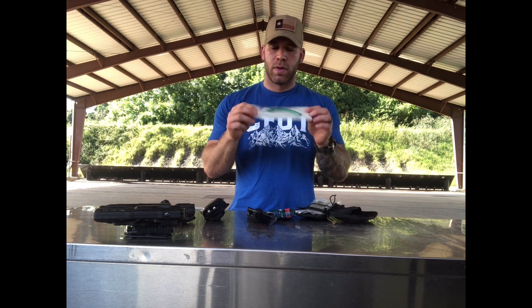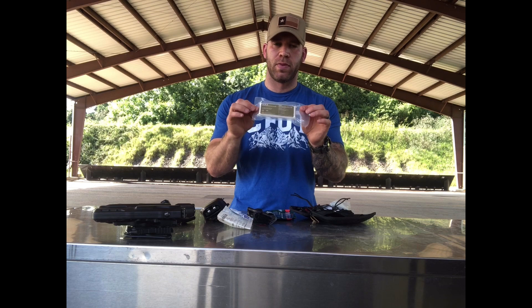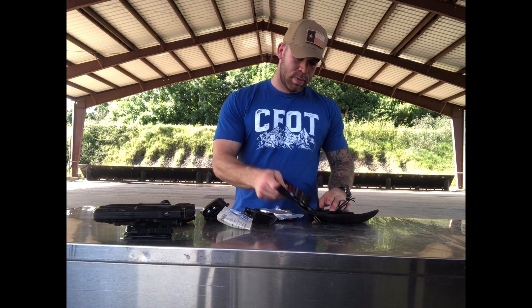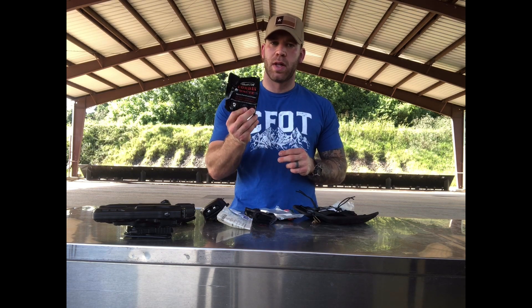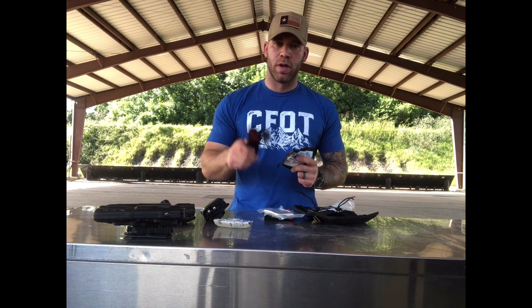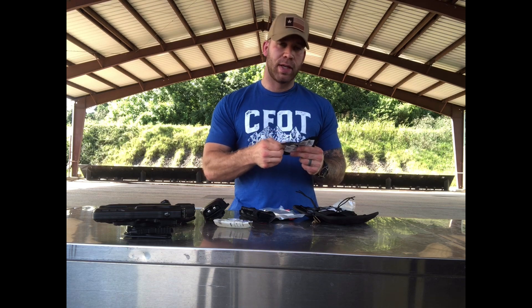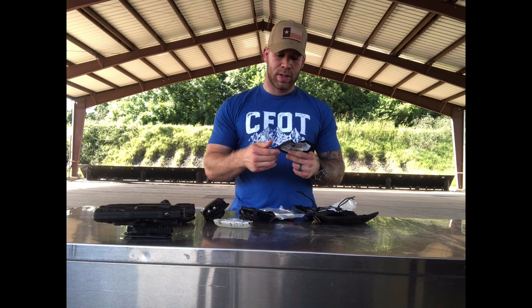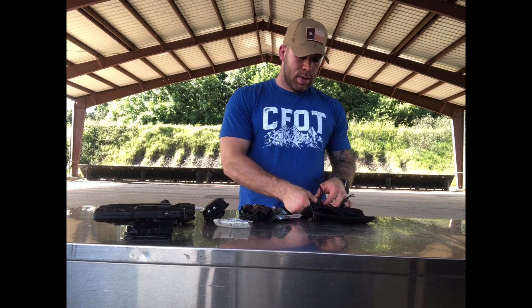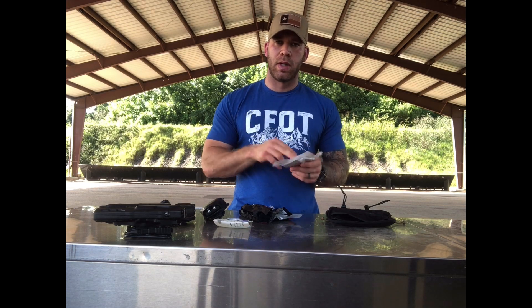An NPA is next for clearing the airway. On the other side you have your flat, compressed, regular sterile gauze. Then combat gauze — hemostatic, it's got your QuikClot in it. Any type of wound that you can't control with a tourniquet, you're going to do some type of wound packing. What you'd like to have is QuikClot or some type of gauze impregnated with a hemostatic agent that's going to help your body's natural clotting factors. Once you get a good wound pack, lastly we have our compressed elastic wrap to create a good pressure dressing to keep pressure on that wound.